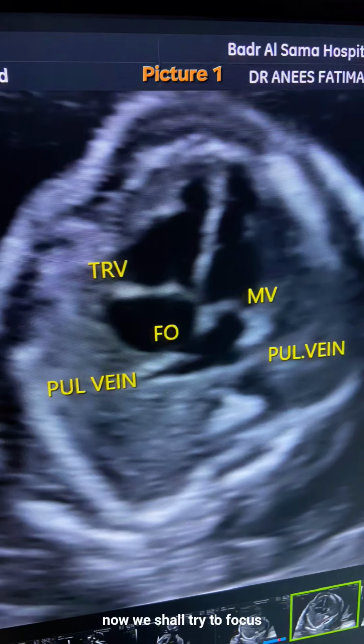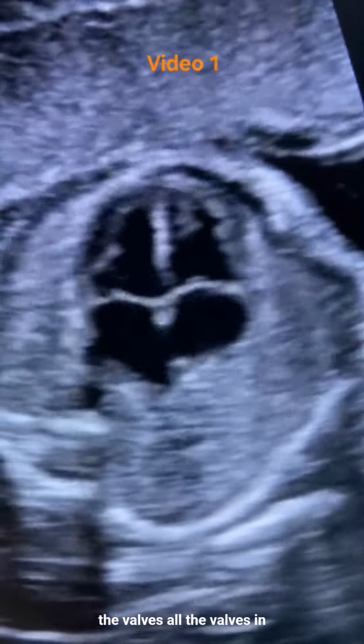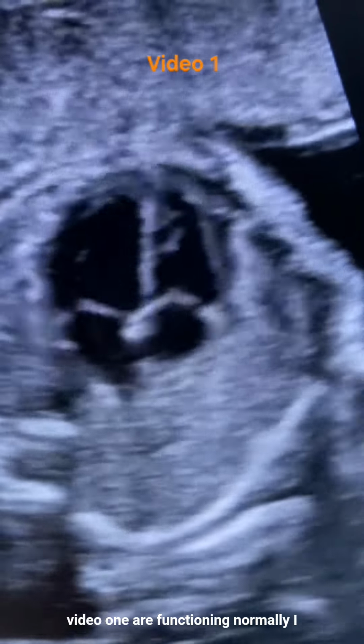Now, we shall try to focus on a very important anomaly of the fetal heart, the atrioventricular septal defect. Picture 1 is a scan of a normal heart. Concentrate on the normal offset appearance of the valves. All the valves in video 1 are functioning normally.